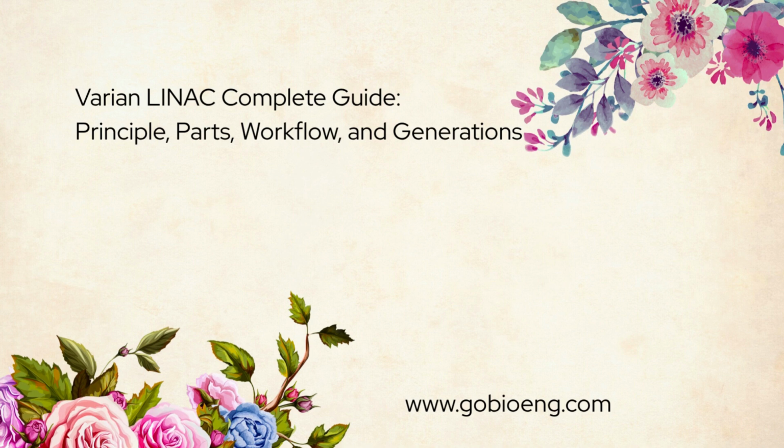A Varian-medical linear accelerator, or LINAC, is a device designed for external beam radiotherapy. Its role is to generate high-energy radiation, shape it with care, verify the patient's position, and deliver the planned dose to the treatment area while keeping exposure to healthy tissue as low as possible. Put simply, a LINAC takes electrons, increases their energy, uses them to create radiation, shapes that radiation, and directs it toward the patient with precise control.